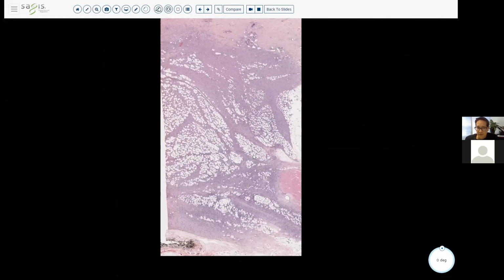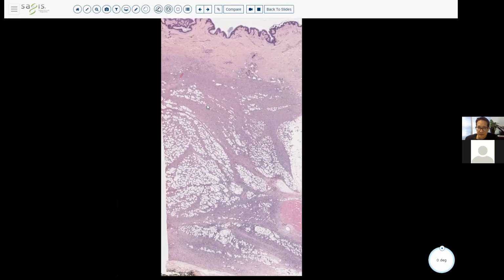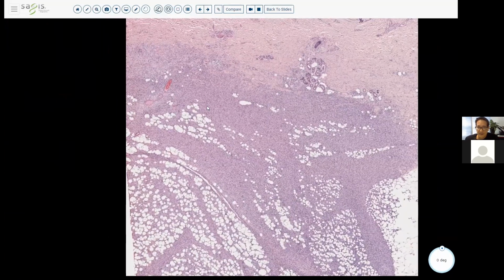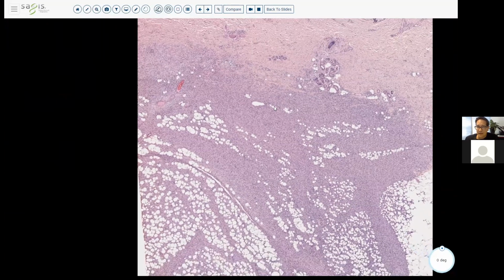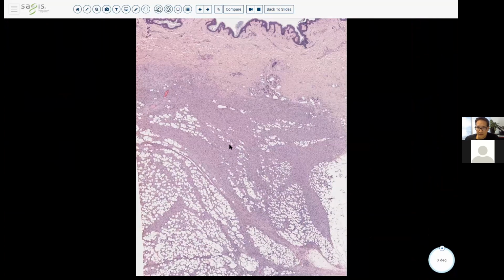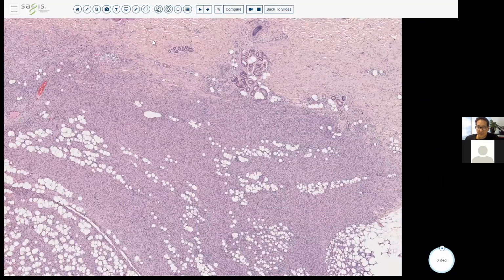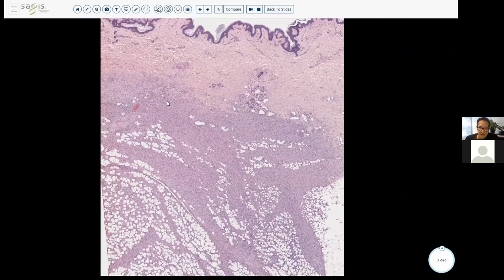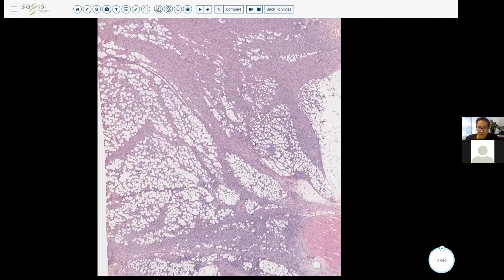You don't always see the fat in a biopsy, but just look. Even at the surface of this lesion, you can see that it's involving the fat quite extensively. Again, you're looking at the monomorphous nature of the cells, and then it's going down into the fat. This one is actually quite deep. They can go closer up to the epidermis as well. This one's actually starting way deep and going even deeper down into the subcutaneous fat.